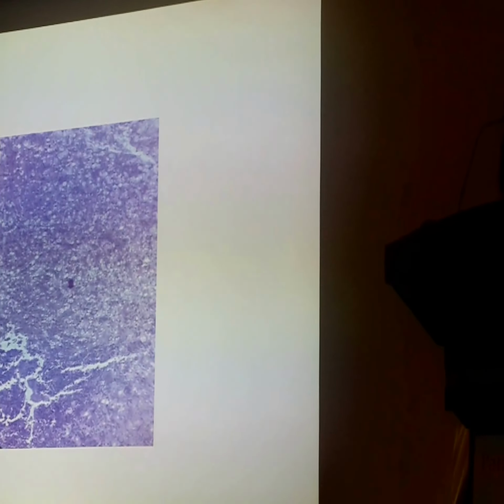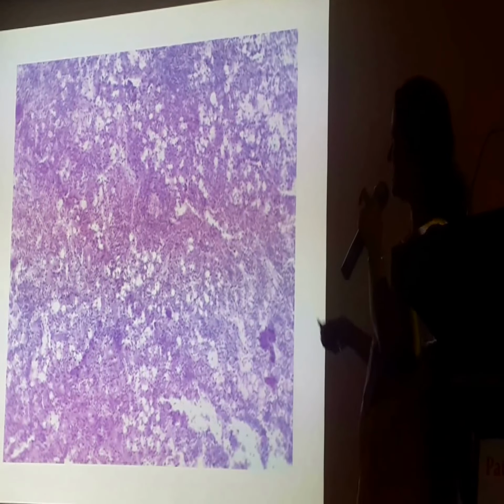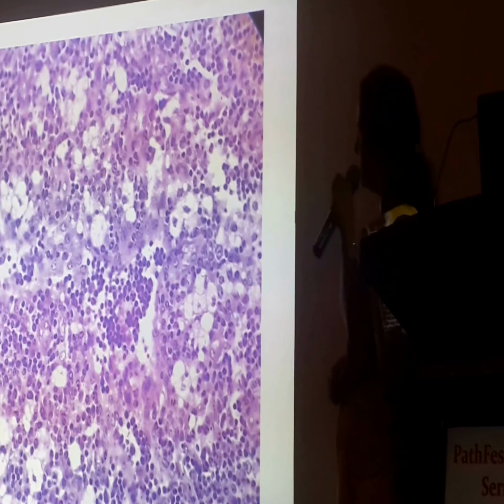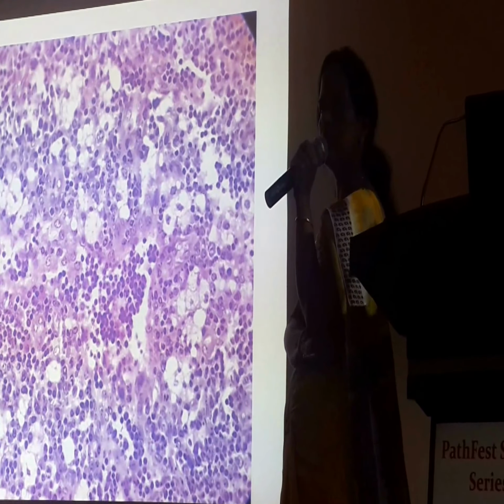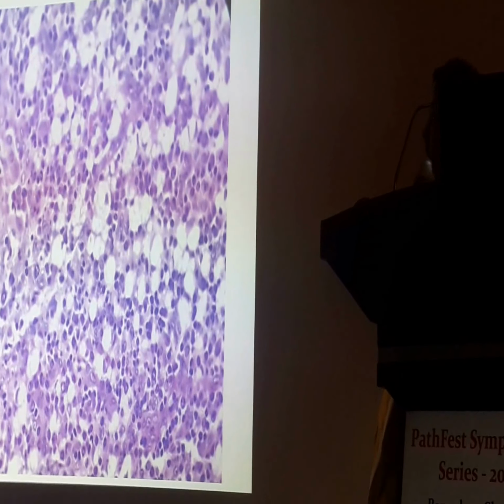Not very clear, and we'll go there. Yes, this is what you said. Some histiocyte-like cells which you see, with follicles in between. A slightly higher power of these histiocytes. The sinuses, sinus histiocytosis, are they within the sinuses? Do you agree they are histiocytes? Yes? Next.